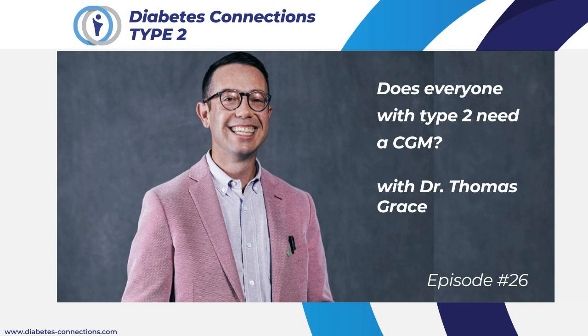Now, this is why we want them on CGM first, because we don't want these lows. As clinicians will all tell you, in treating someone with diabetes, hypoglycemia is our biggest fear. If we have a tool that can give our patients some indications that they may be having those, they can take that back to the clinician or maybe even adjust their medications on their own. I've had a handful of patients come into the clinic saying, hey, I had to turn my insulin down because I'm now not eating as much. Congratulations! They did an excellent job and they didn't even call the office to do that.